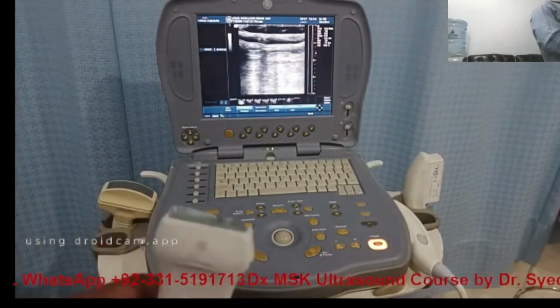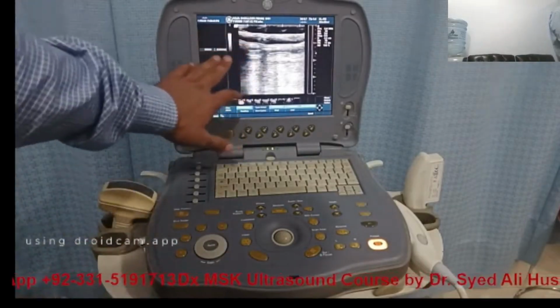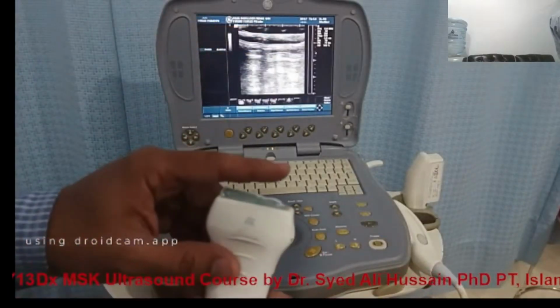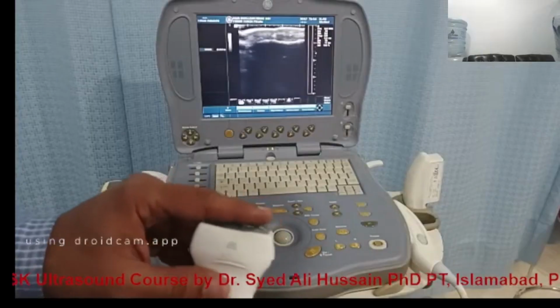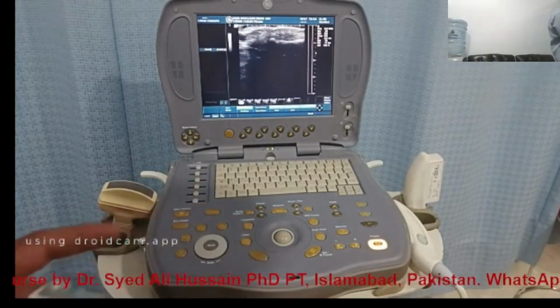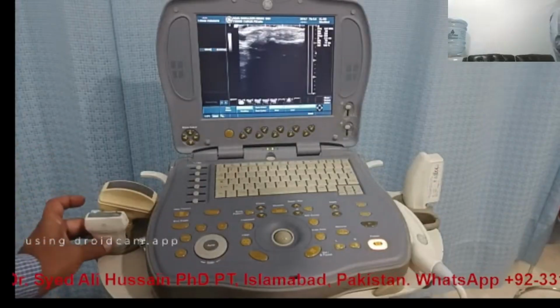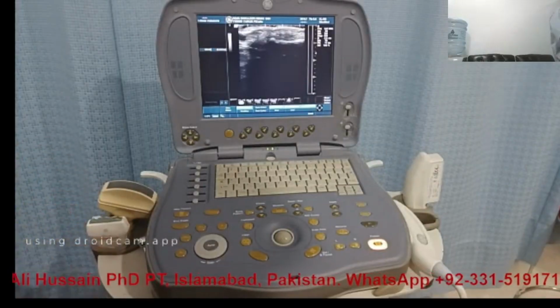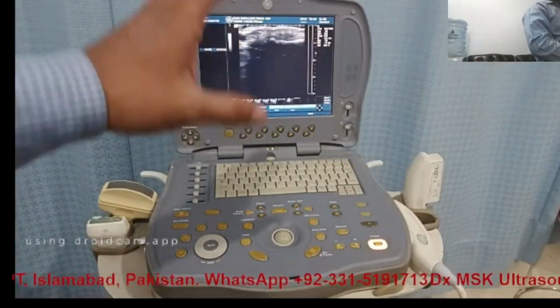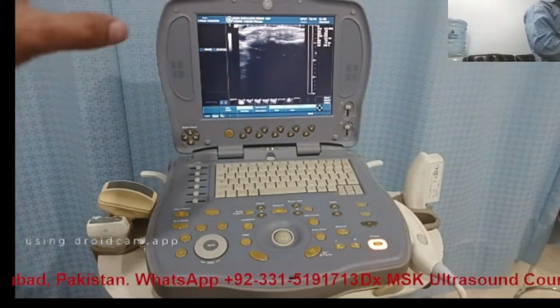So now you can see I have applied the gel, and here are the lines. If I press unfreeze and I place my finger on top of it, you can see an image is being created. Okay, so everything is fine. So now the image is created. We will discuss how to read the image, but let's see what can be done.